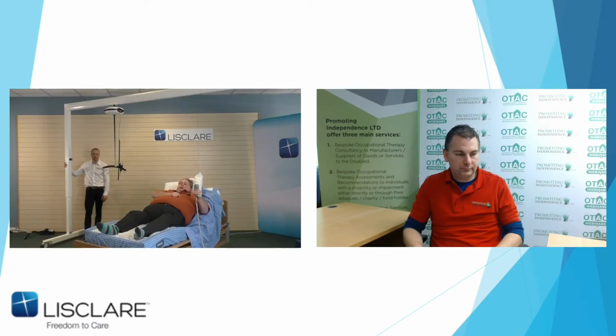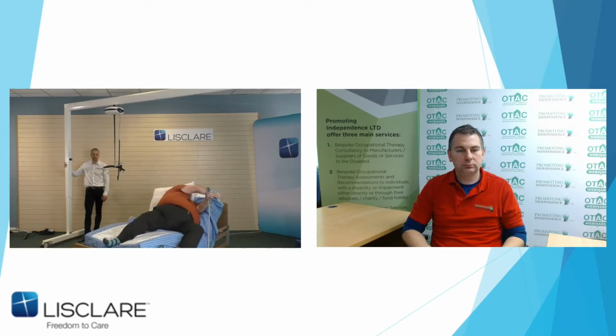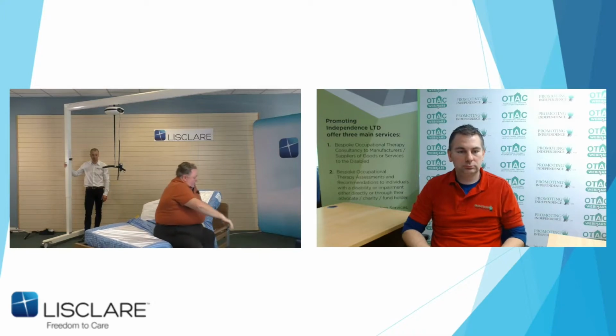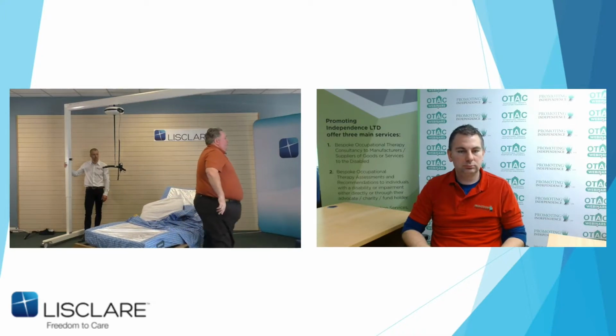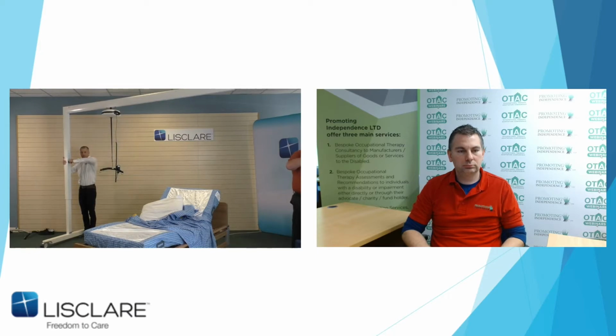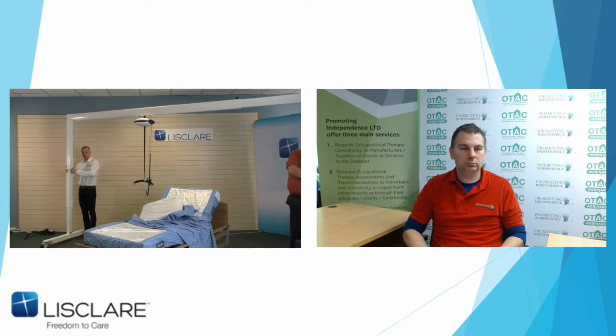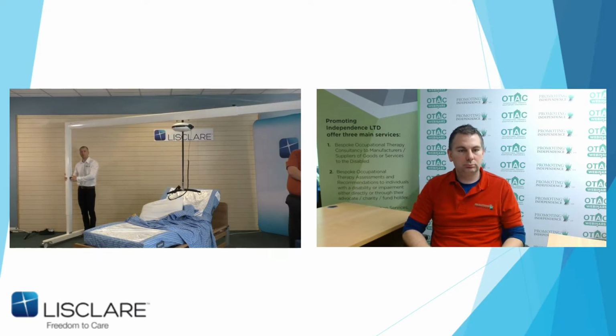What you won't see here is, with this gantry, there we go. It's actually got what looks like a hydraulic pump inside this. So that's why John and I lifted this with ease. If we take it out, we can lock it into various positions, as you can hear. Take it out again, John. There's about 10 different positions all the way up to all the way down.